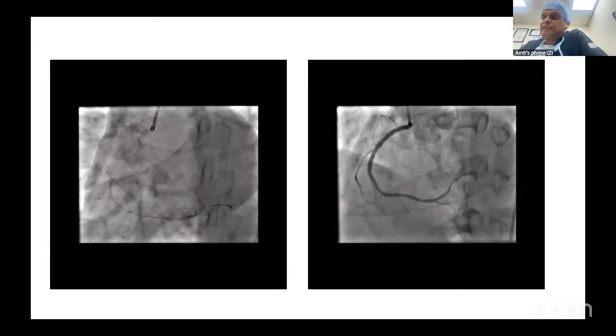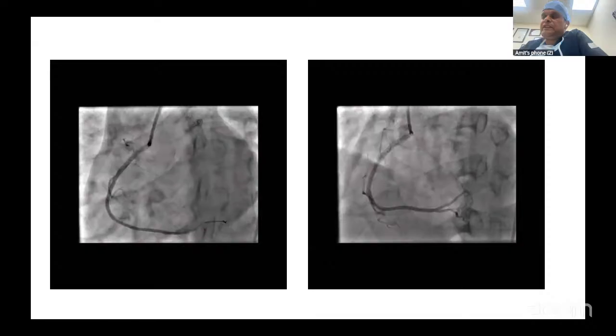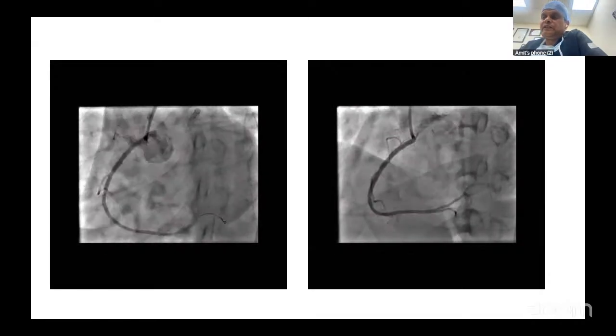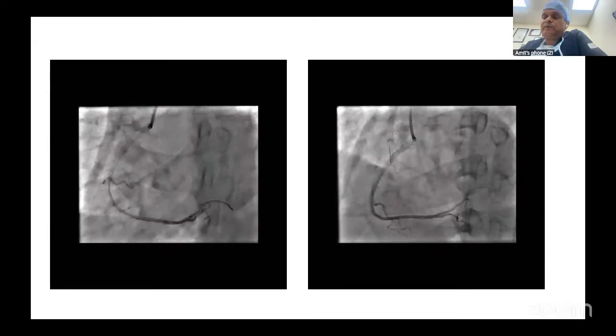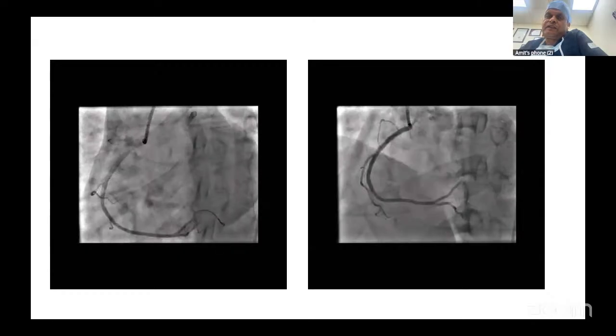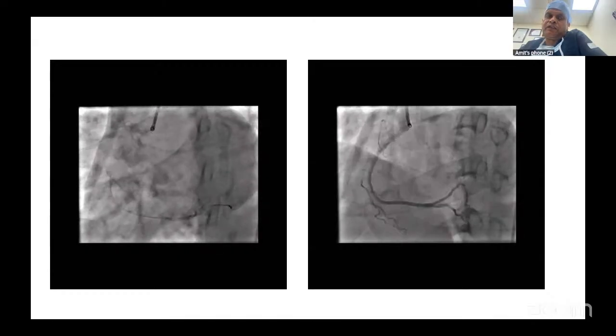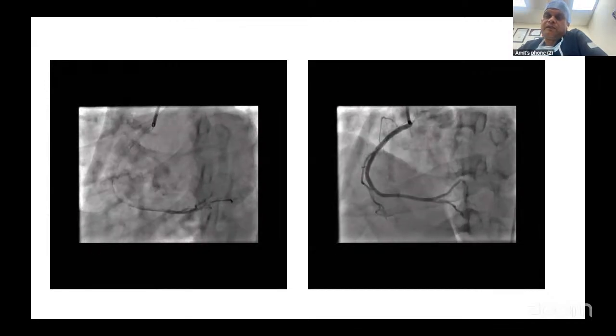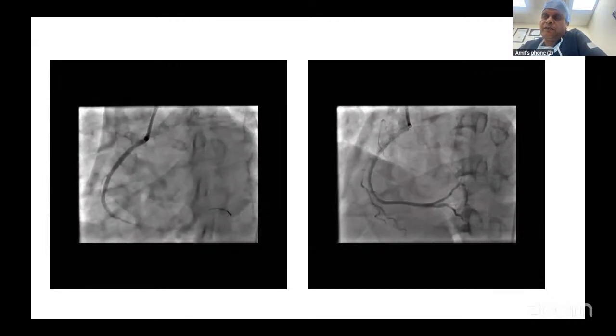In this stent, I could see the shaft of the balloon is not as big as the other stent balloons. So do you think this will be an advantage in ostial placement where, sometimes if the shaft is larger, it closes up the other side vessel?